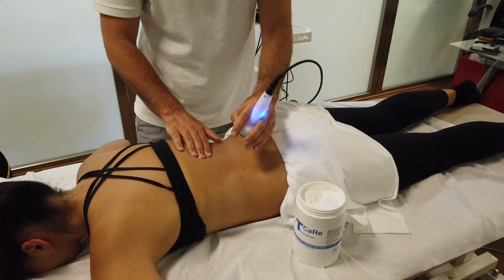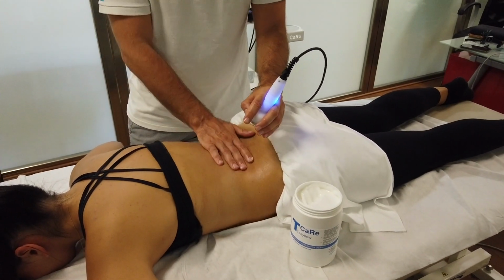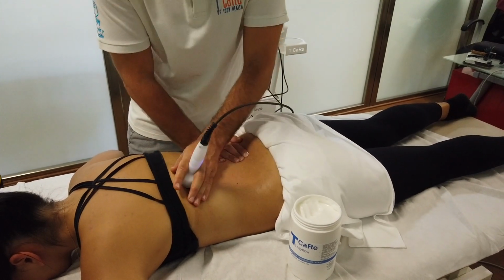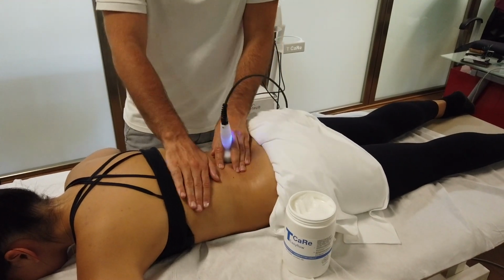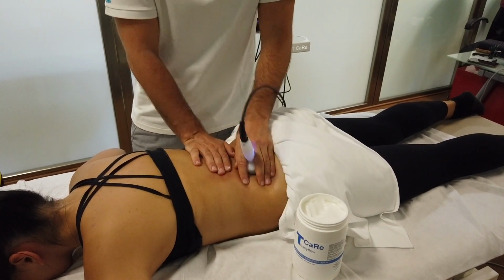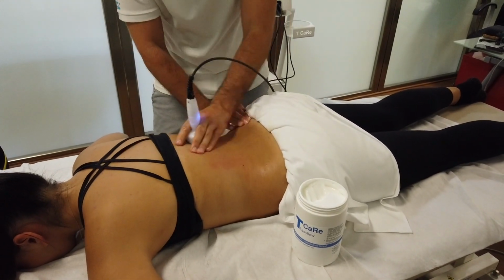Now I change the electrode and I use the bipolar electrode that I explained to you is used in aesthetic medicine, but I can also use this type of treatment in musculoskeletal disease, because with this type of electrode my target is to warm up the superficial tissues quickly. So I choose this type of treatment when I want to prepare the tissues, for example, before manual therapy, before, for example, a high velocity, low amplitude technique. So it's very useful in this type of treatment.